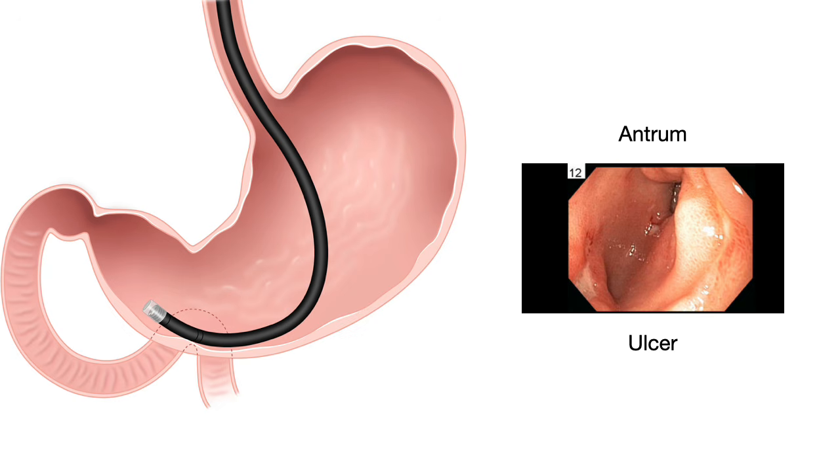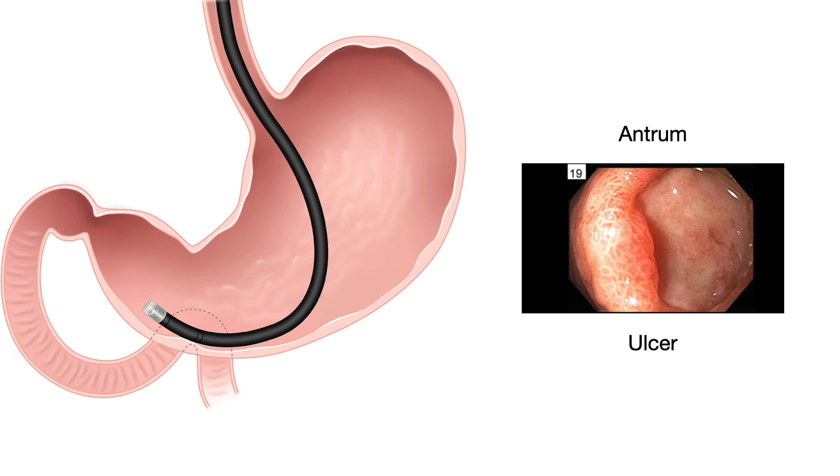And here is a close-up of another ulcer. As you can see, nice clean base, no bleeding site, no bleeding vessel, and here is the edge that you take biopsies from.